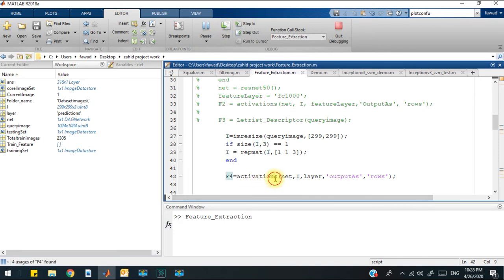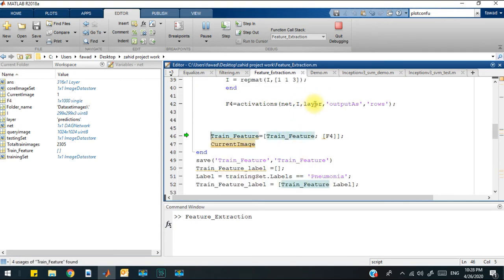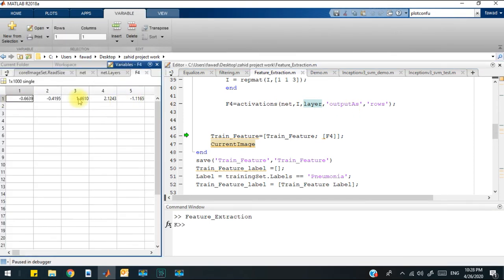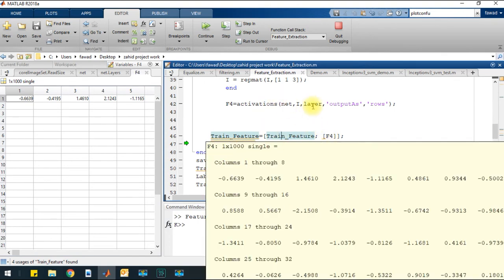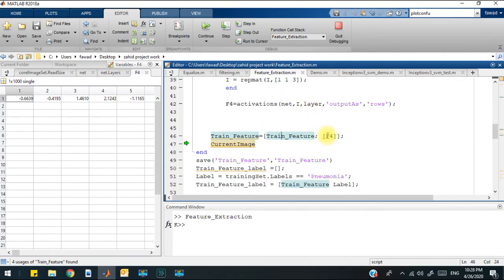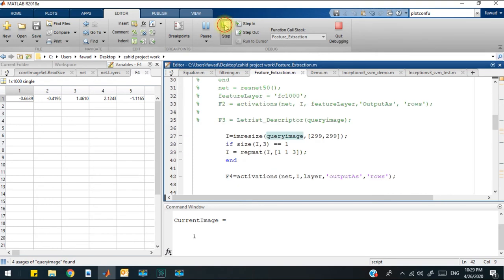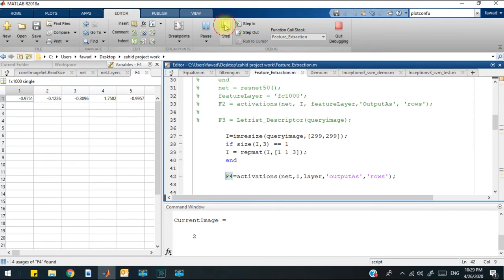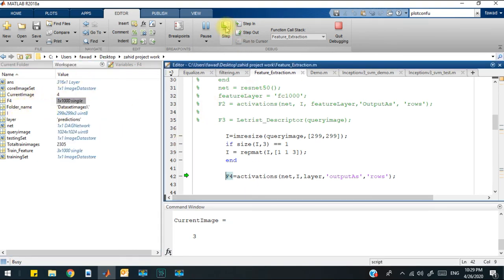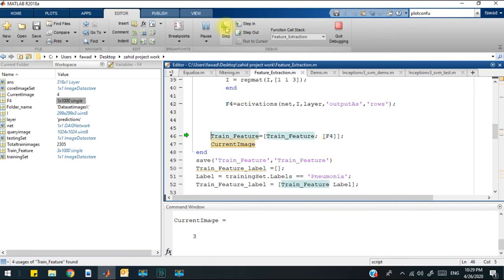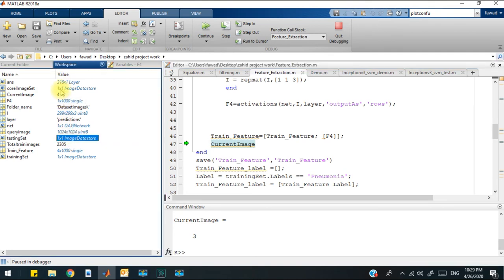Now you can see that through the activation function, we have extracted features from the prediction layer, and that feature vector has been organized in the shape of a single row with 1,000 variables. We will concatenate the extracted features with the previous set of features row by row. If you look into this code and we execute this code line by line, you will see that after executing this code four times, the train features contain four rows because the loop has been executed four times.